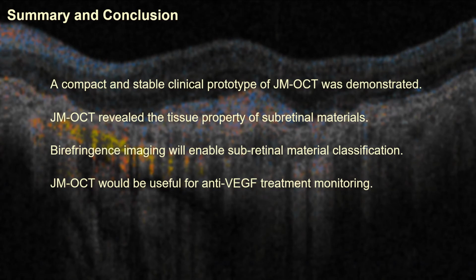In this presentation, I introduced a new compact and stable clinical prototype of Jones-matrix OCT. The Jones-matrix OCT revealed the tissue property of subretinal materials. The birefringence imaging will enable subretinal material classification, so the Jones-matrix OCT would be a useful tool for anti-VEGF treatment monitoring.